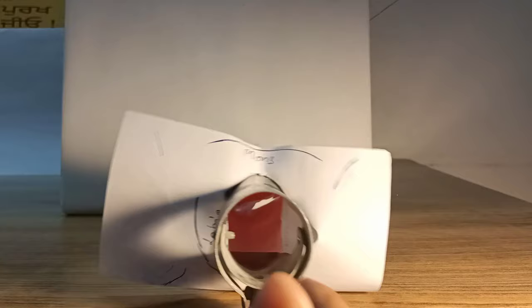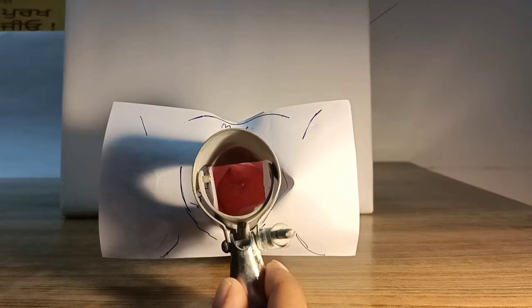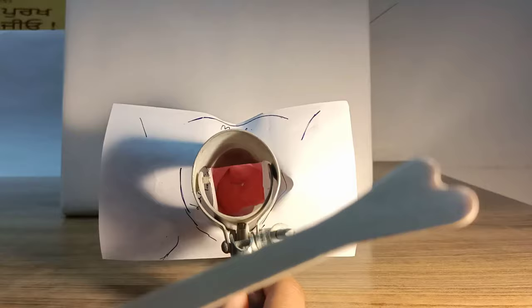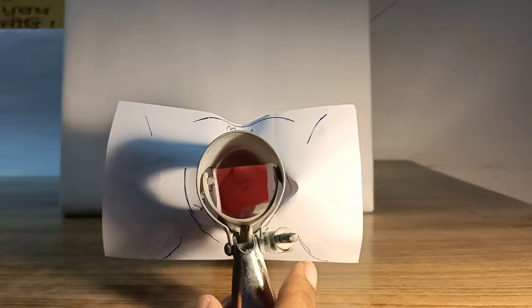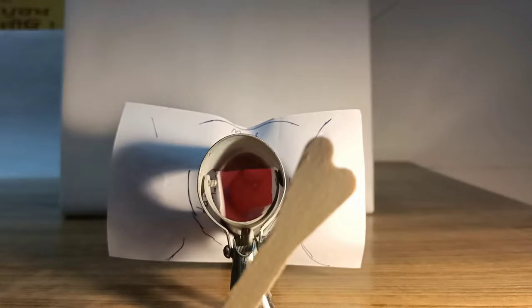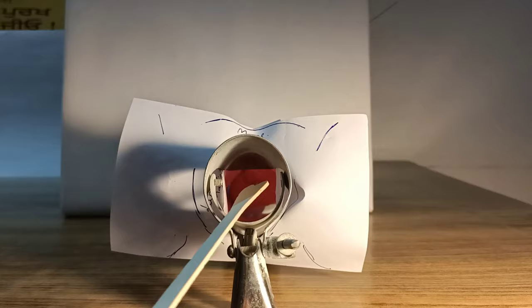There you see is my os. Now if I have to take the pap smear I require an Ayre spatula. I'm going to introduce my Ayre spatula. The longer end is going to go inside the os and the smaller end is going to remain outside the cervix, and we are going to make some rotations.